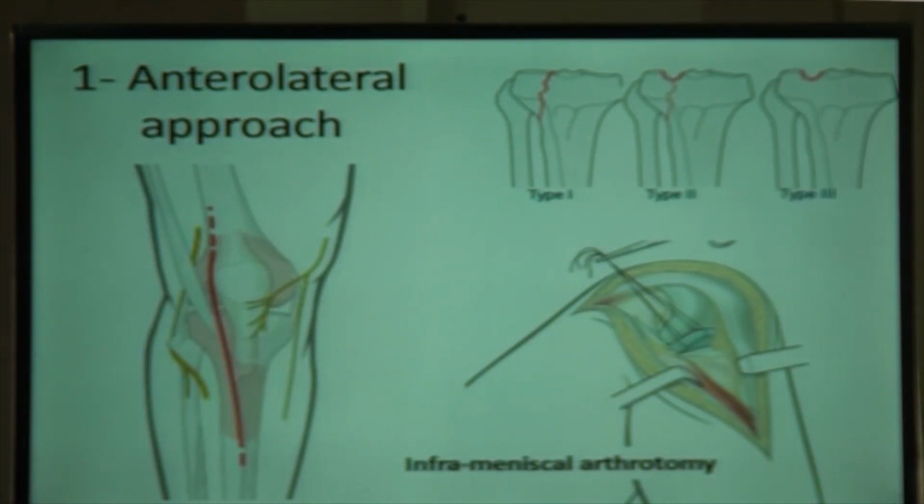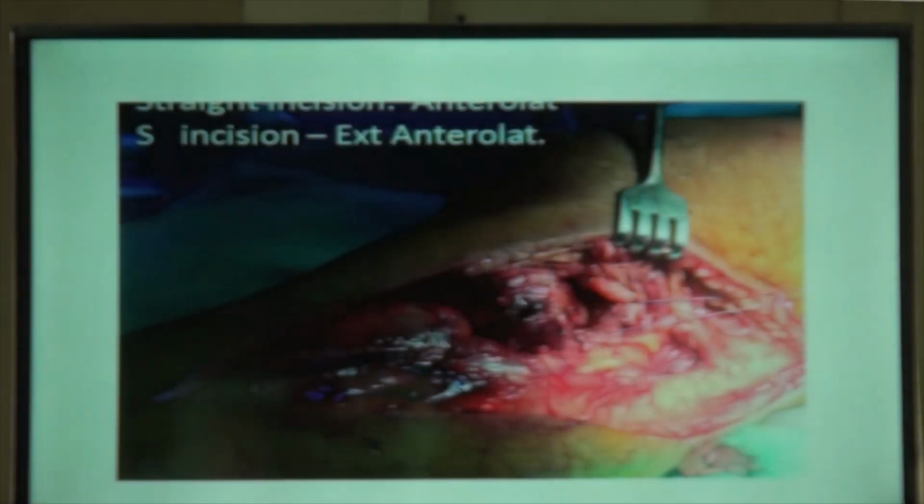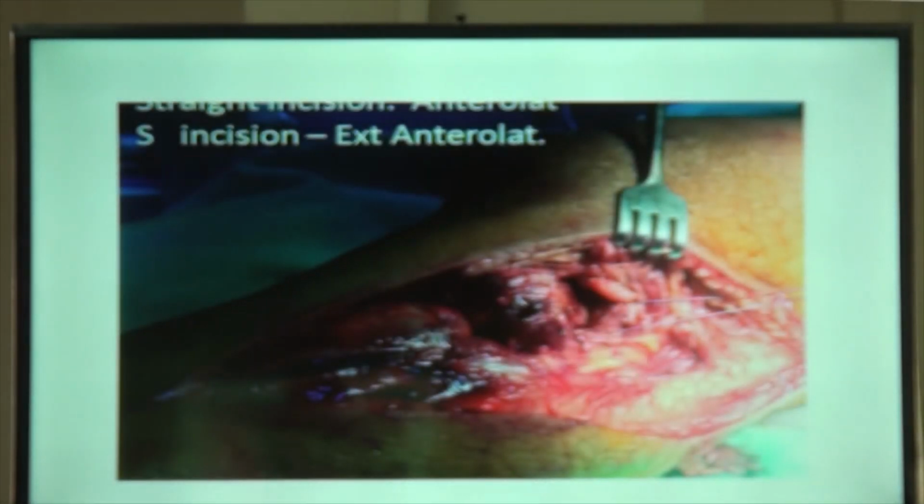that you go midway laterally to the patella, you open up distal to the joint, the ITB, you're exposing the meniscus, you lift the meniscus up, submeniscal approach to get to the joint line, you're reflecting your extensors on the upper tibial surface, then you go into the ITB, you lift the meniscus up, and then you see the articular surface. This is the classic lateral approach. And this is what we're going to start with now. Do not do more than this. Then we're going to go later to the extended anterolateral. So stop at this stage.